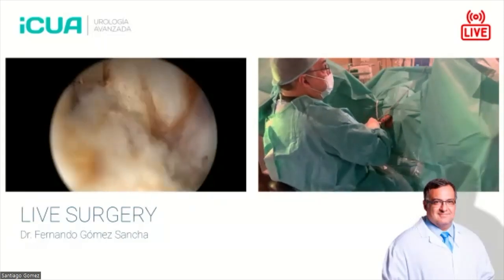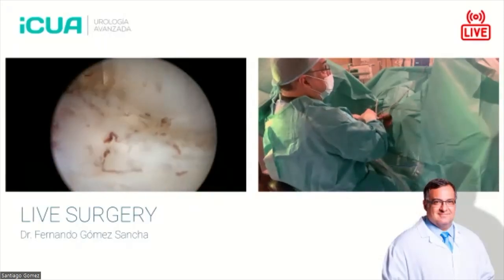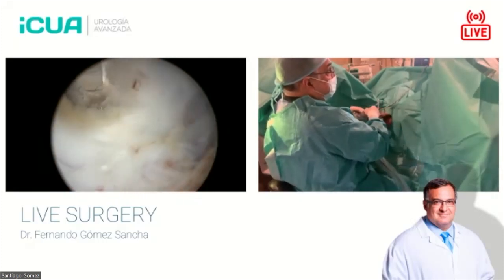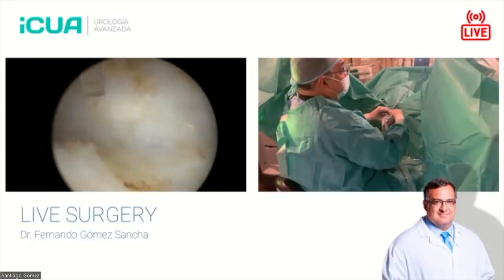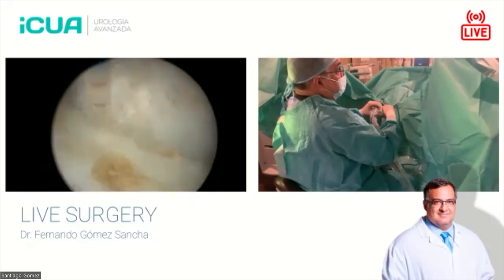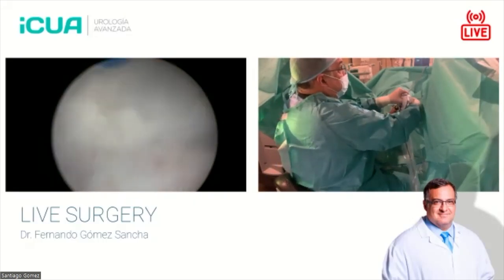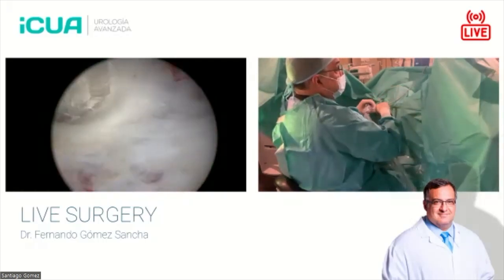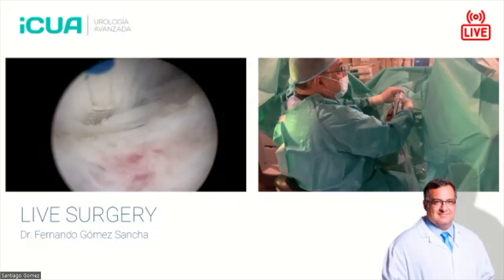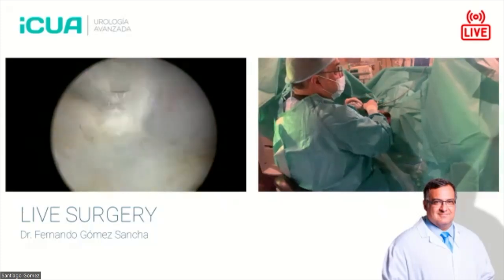And you will ask yourselves, how is that possible? Why does holmium dissect the plane, and why does thulium, or thulium fiber, not dissect the plane so much? To understand this effect: the wavelengths are very similar. 2 microns for thulium, and 2140 nanometers for holmium. So the tissue effects and the interaction with water are very similar as well.